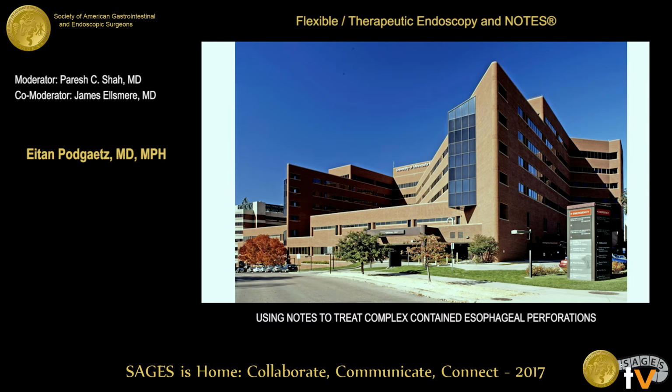But I think if you look at the way management of biliary sepsis played out in T tubes and then nasal biliary drains, who uses those today for managing biliary sepsis? It's almost entirely managed with endoscopic biliary drains, right? Plastic, or it's all internal. And then we saw the same thing happen with pseudocysts. It was largely all managed with internal drainage, and it turns out that in a lot of the esophageal stuff there's emerging evidence now that you can do the same sort of thing, just internal drainage, double pigtail stents, and that you don't actually need to have the external drainage component. But it's emerging, and it's a fascinating field.